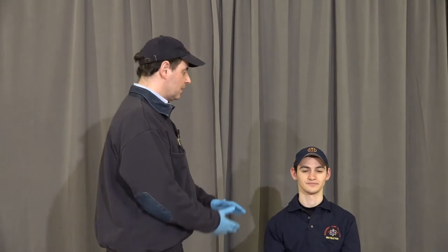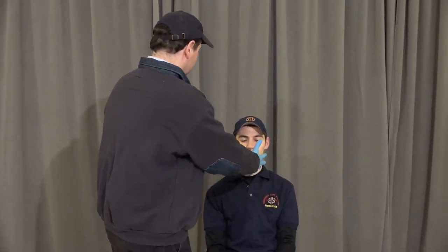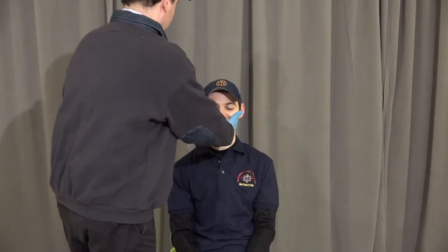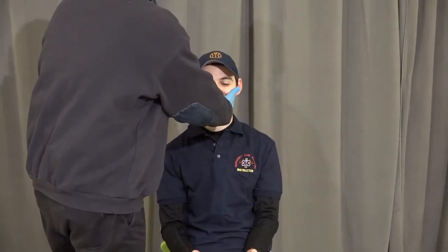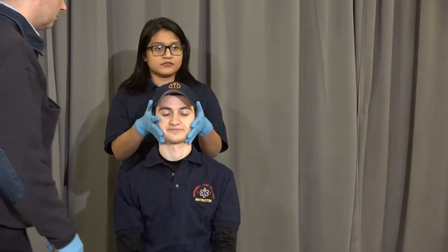The application of the shortboard. BSI — my scene is safe. I'm going to approach my patient from the front. Please don't move. Holding stabilization from the front and directing my partner: please hold in-line stabilization, and please don't move.